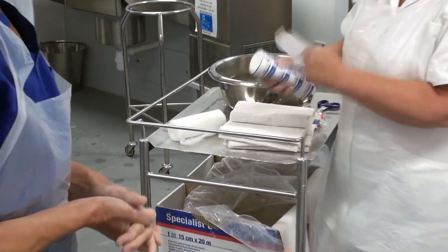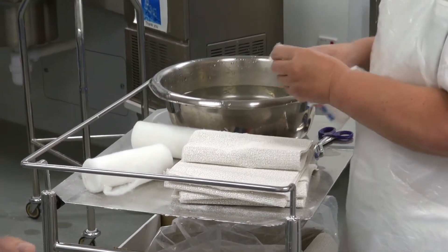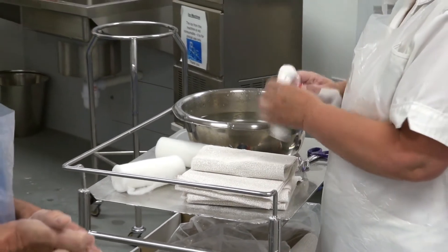Pam has got some padding now and she's also going to pre-shrink some cotton bandages ready to apply at the end to secure the slab in place.